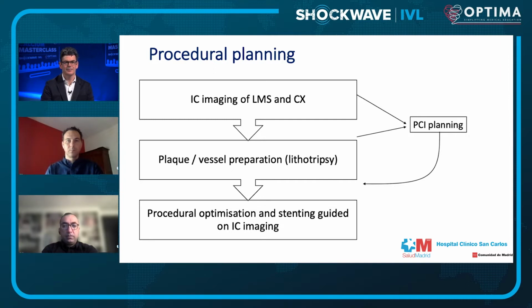For this particular case, we thought of lithotripsy as the best choice in terms of plaque preparation technique. Why? Because there is certainly no device that can achieve plaque preparation in such a large vessel and with such a high degree of plaque. We will be concerned that even if we use a 1.75 or a 2 millimeter burr for rotational atherectomy, we will not actually make adequate changes in this huge nodule of calcium that we see there.